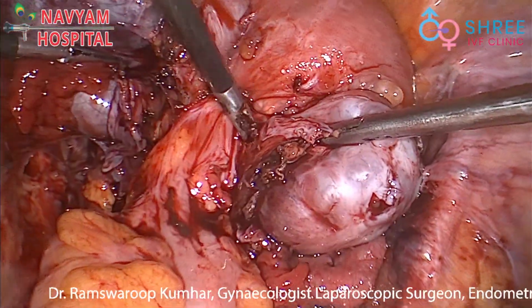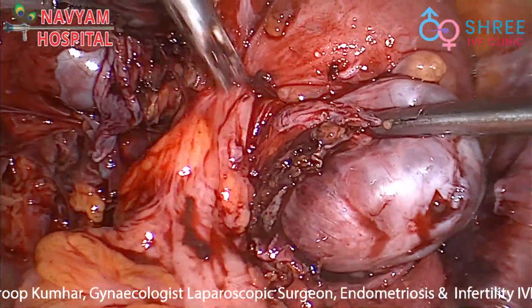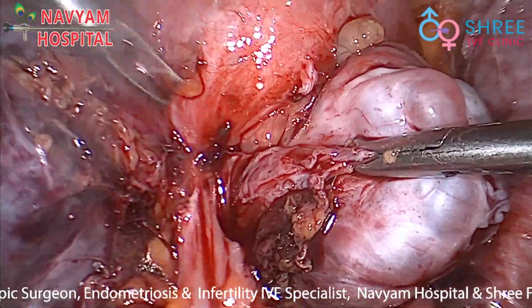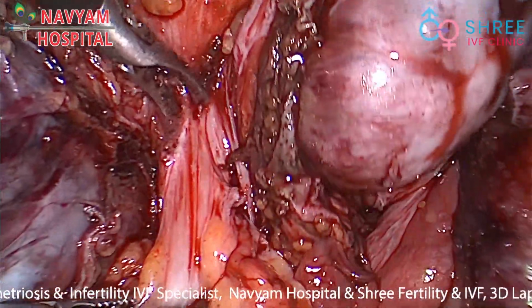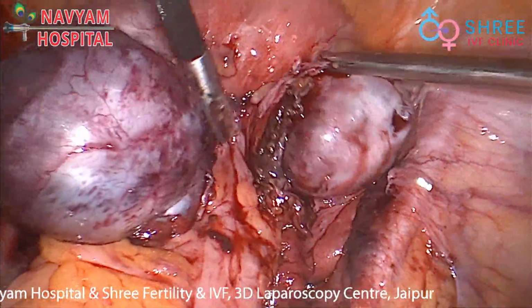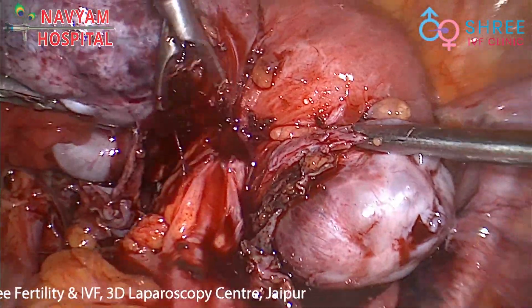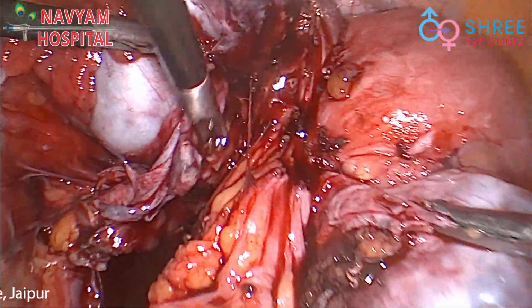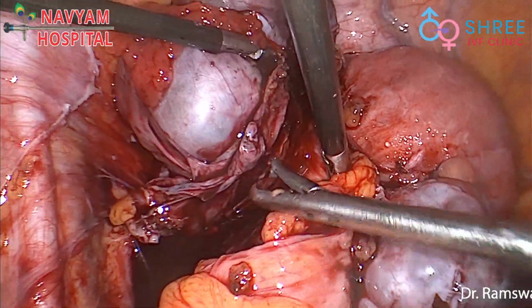After securing both ureters and cutting both uterine arteries at the origin, our further dissection was to the rectum. The cyst was here accidentally ruptured and hemorrhagic fluid seeped out.